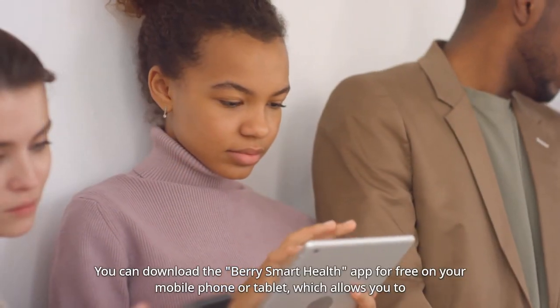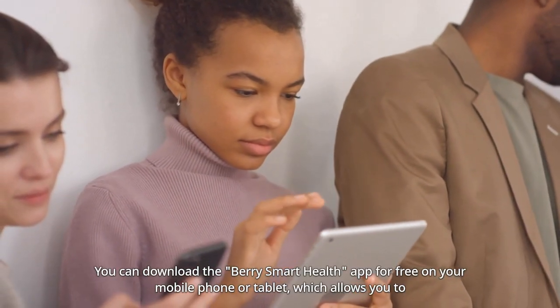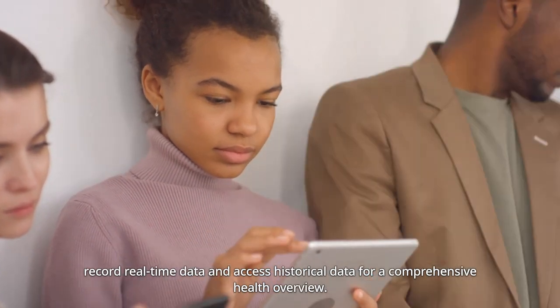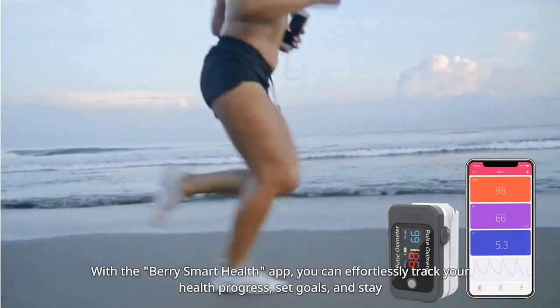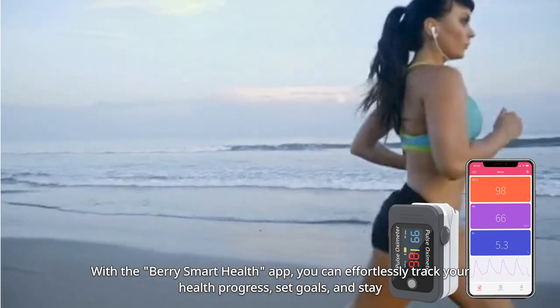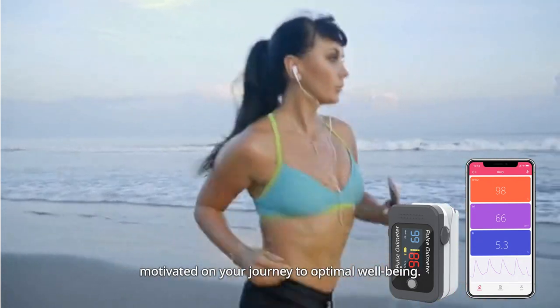You can download the BerrySmart Health app for free on your mobile phone or tablet, which allows you to record real-time data and access historical data for a comprehensive health overview. With the BerrySmart Health app, you can effortlessly track your health progress, set goals, and stay motivated on your journey to optimal well-being.